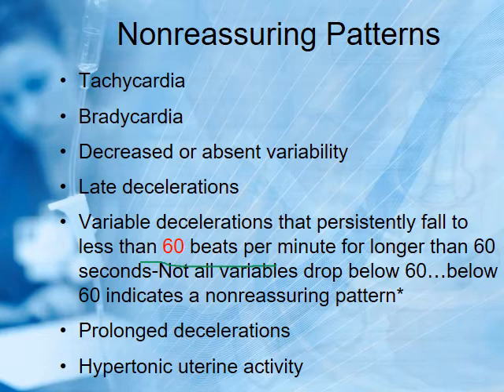Those prolonged decelerations, if they recur, that's a concern. If they happen one time and we've given the oxygen and turned the mom and done the IV fluids and they don't happen again, we don't get panicky about that. But if they persist, then we have to, of course, notify the physician and perhaps get ready to go to OR. And then the hypertonic, too many uterine contractions.